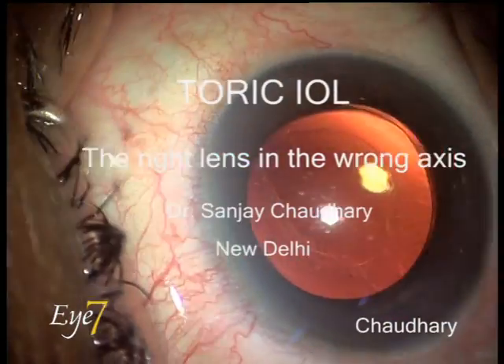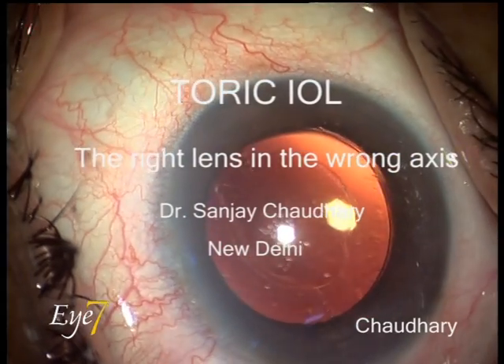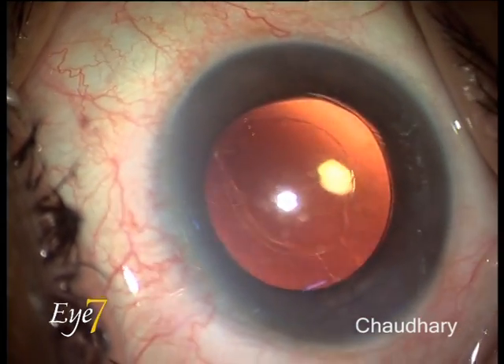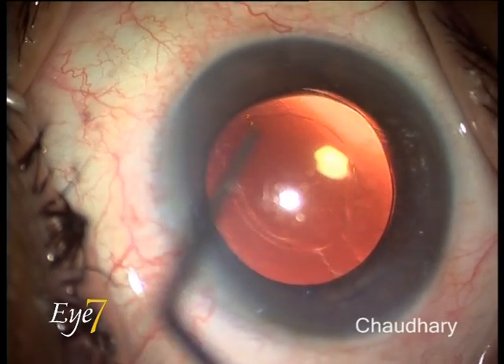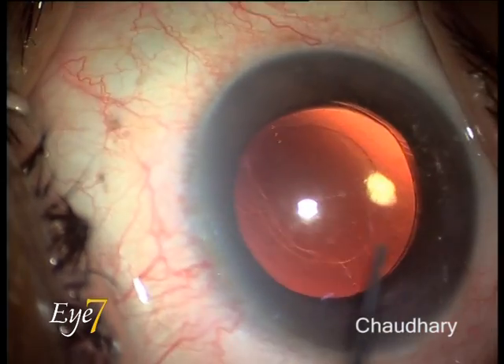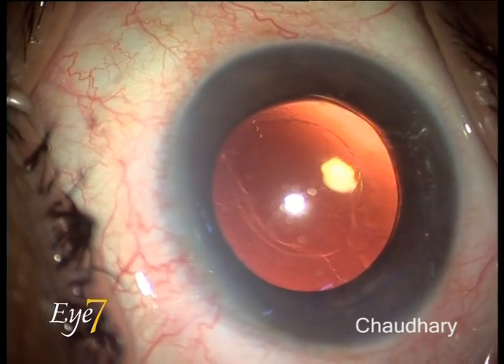This is a presentation on Toric IOL — the right lens in the wrong axis. This lens is presently lying at the 180 degree axis, and you can see the three axis marks on either side. When this patient came for a routine follow-up on the 15th post-operative day, we encountered a refractive surprise.